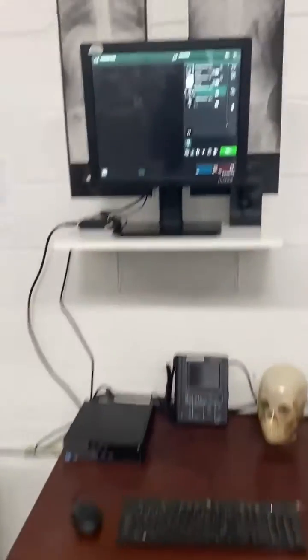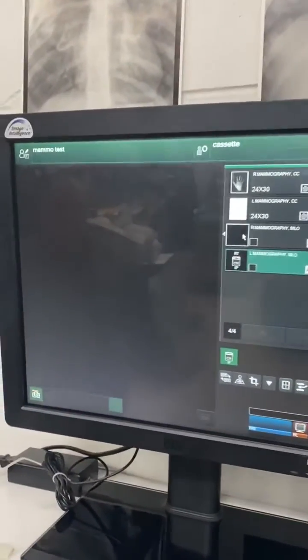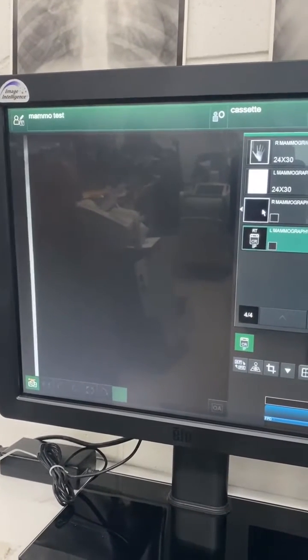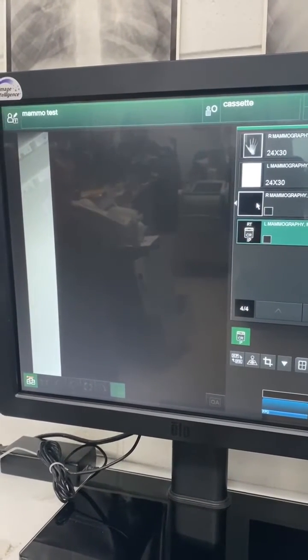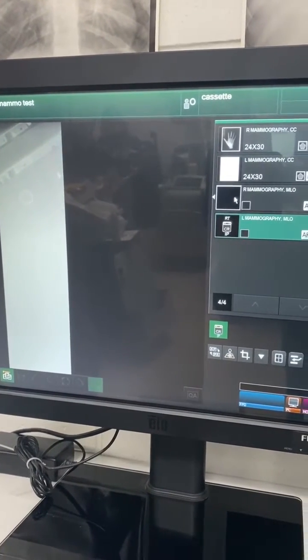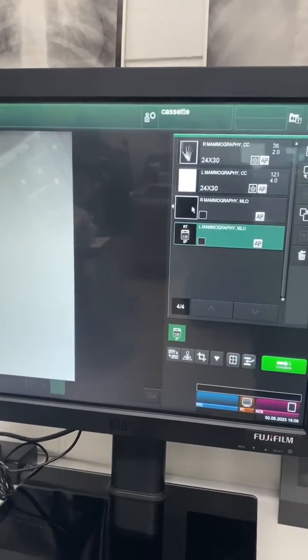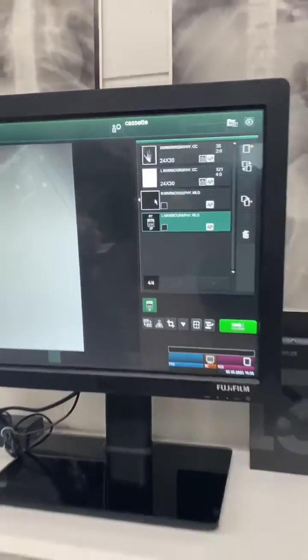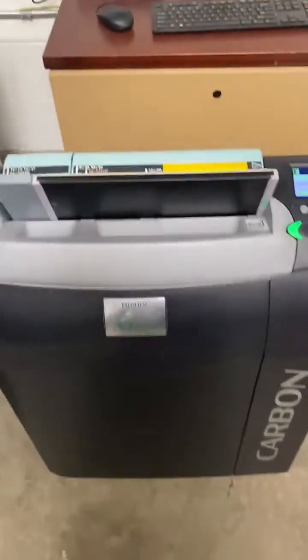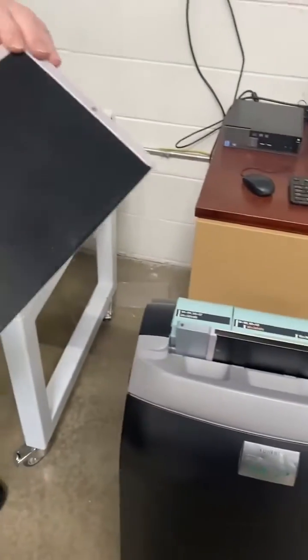We're going to set up for mammography here. As you can see, we just put a hand phantom on our x-ray, and we have taken both sizes — the 18x24 and the 24x30. You can see it will run that cassette fine on the Fuji, and we've also got the 18x24 cassette, which will run in here too.